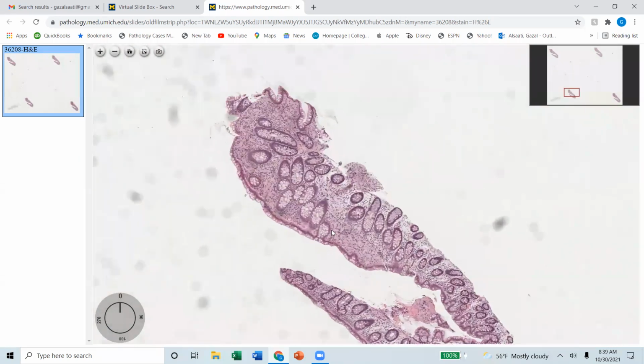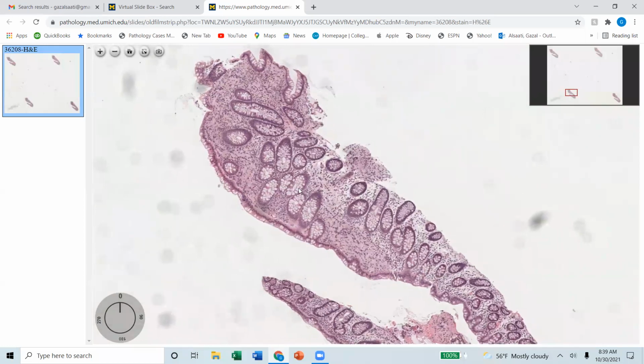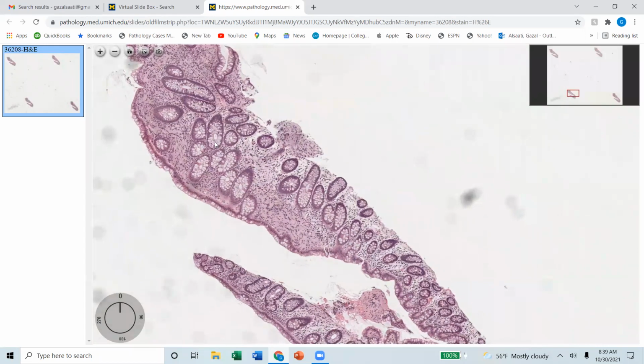And then that tricks me to look a little bit higher. I always screen my glands. My glands should not show hyperplastic features. They have to be small and round and no hyperplasia, okay? If you have hyperplastic changes, you're dealing with a perineurioma.